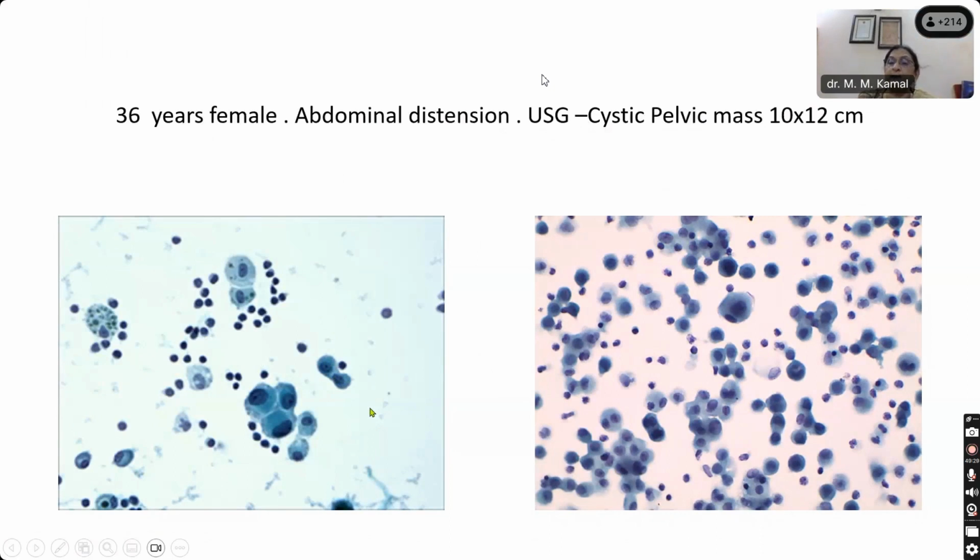It's the normal histology of the mesothelium. There is a single layer of mesothelial lining cells, and then beneath it you get the sub-epithelial connective tissue. So they start exfoliating in the same manner when they are not very hyperplastic or hypertrophic. Now, do you feel that these cells are very hyperplastic or hypertrophic, or are they just normal looking? Are they of normal size and shape?